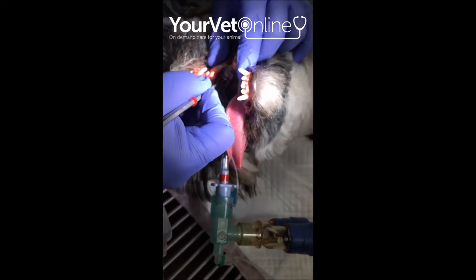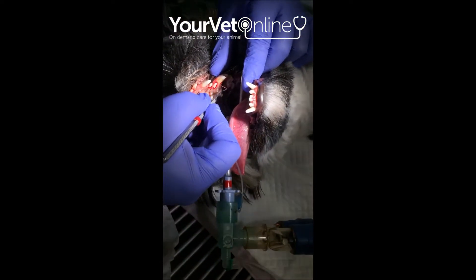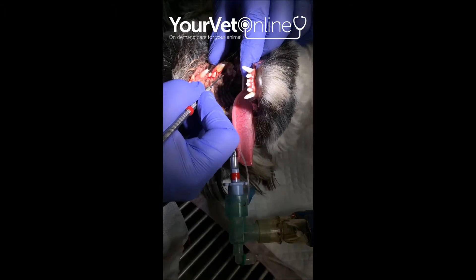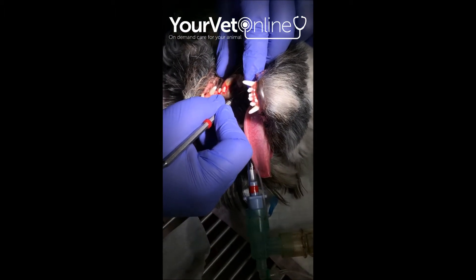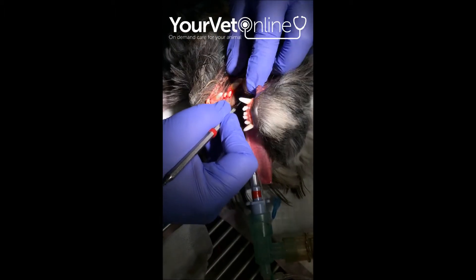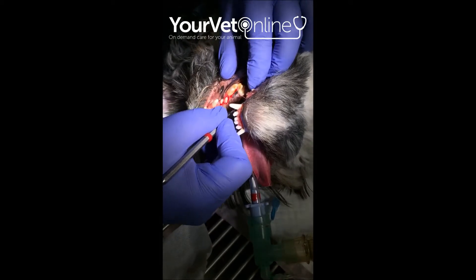We're also looking at the crown of each tooth — that's the white part — and we're checking for signs of fracture, enamel wear, and pulp exposure.